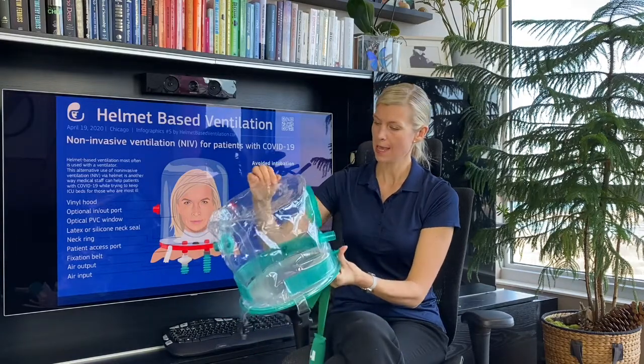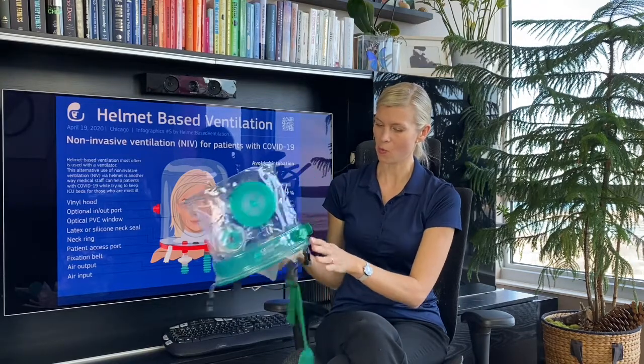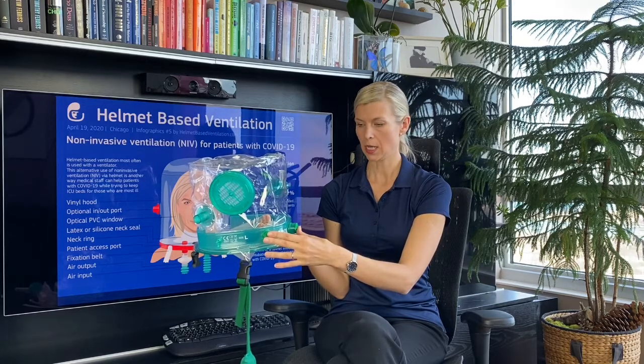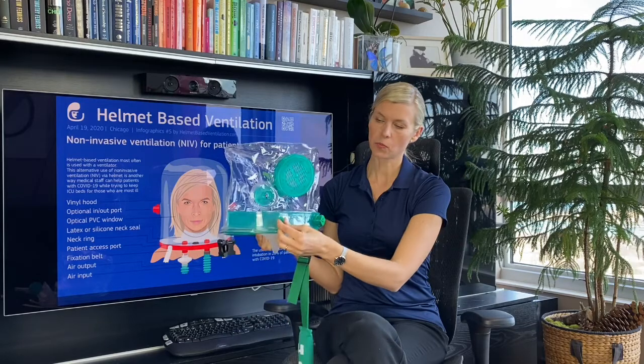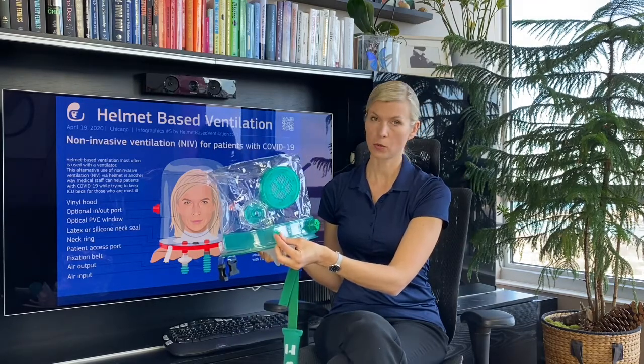The top part has a few ports. On the front and the bottom there are ports for any tubings or lines. Also there's a small port for monitoring CO2 levels or pressures.